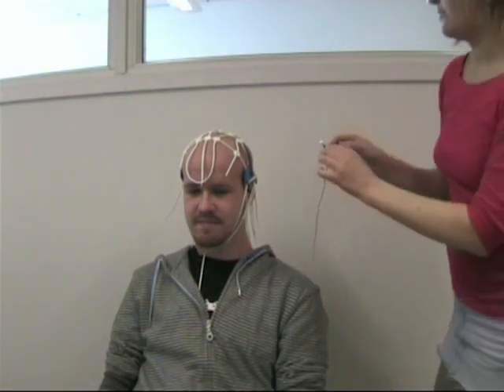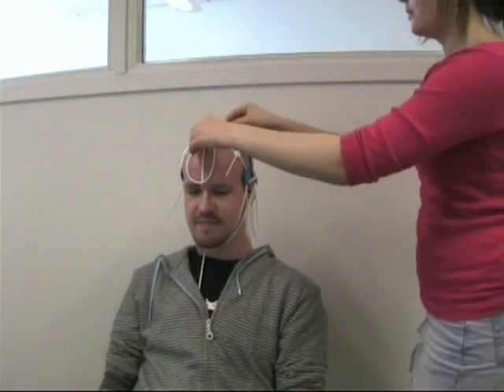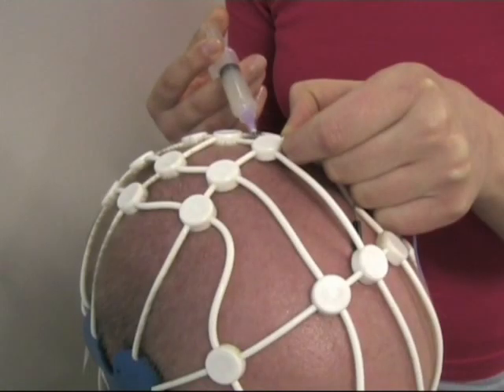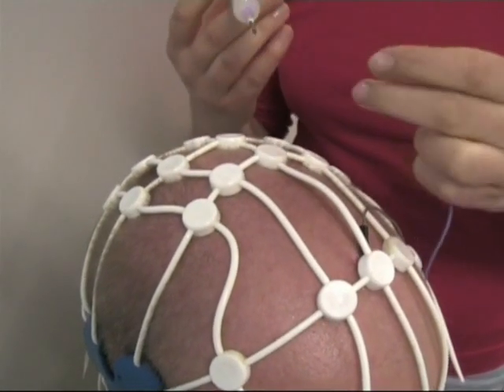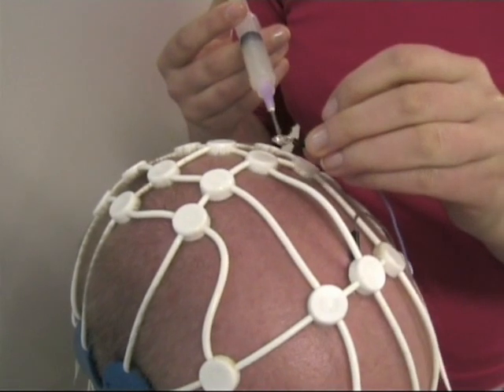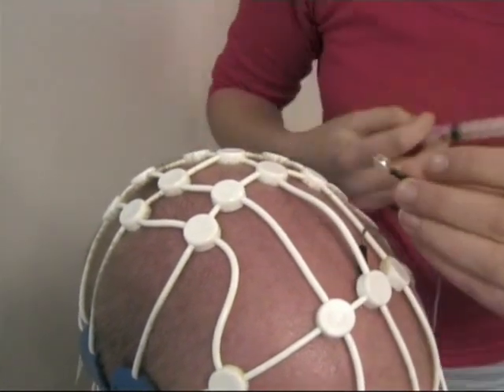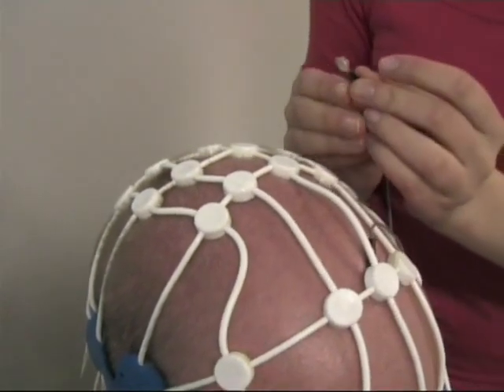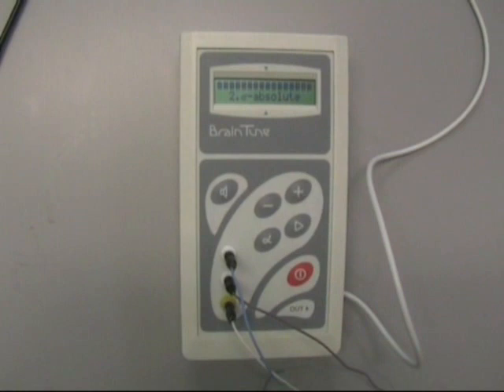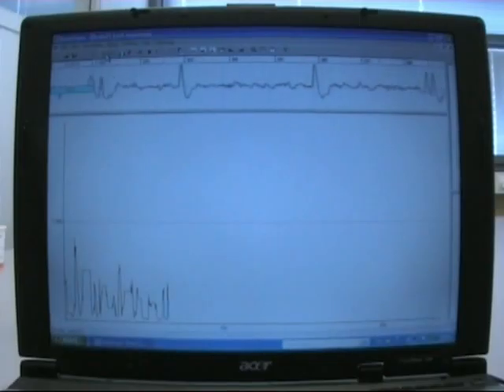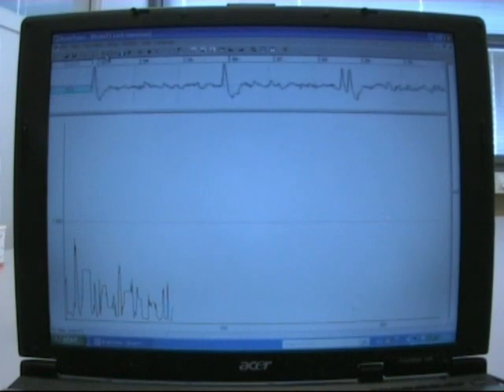To make the helicopter fly with your brain, we first have to attach electrodes to the scalp. The electrodes register the electrical activity in the brain and send the analog signals to Braintune, a box that amplifies the signals and converts analog signals into digital signals. Braintune filters out the desired frequencies, and the strength of the output signal is based on how strong the brain activity is in the desired frequency range.